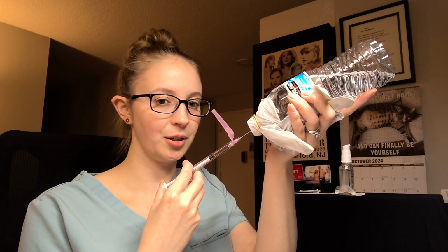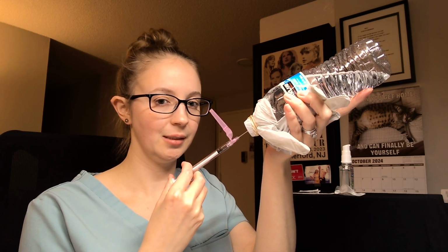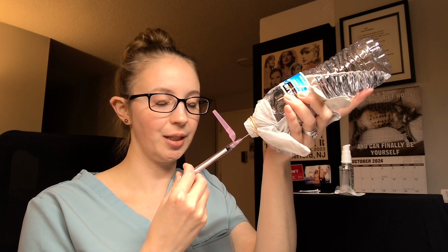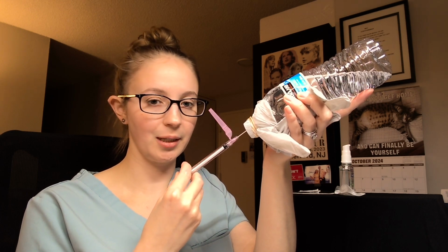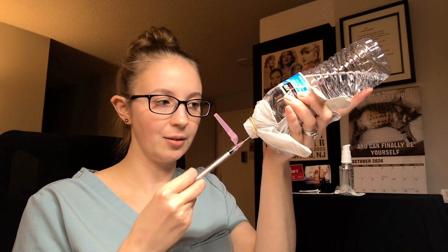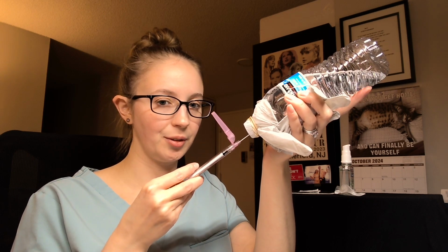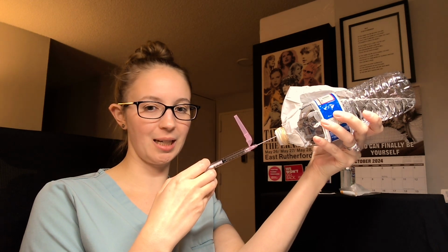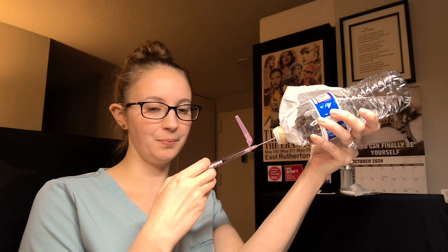You're going to push your air in, and making sure that your needle head is submerged in the liquid, you can go ahead and draw out your fluid. Okay, so once we have our medication all drawn up, we're going to go ahead and pull our needle out.